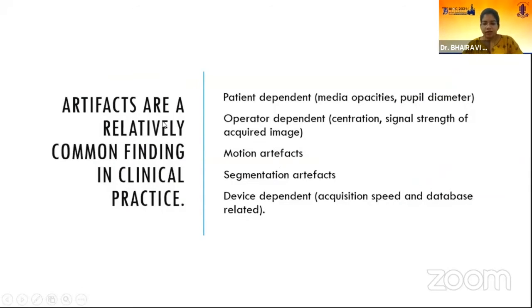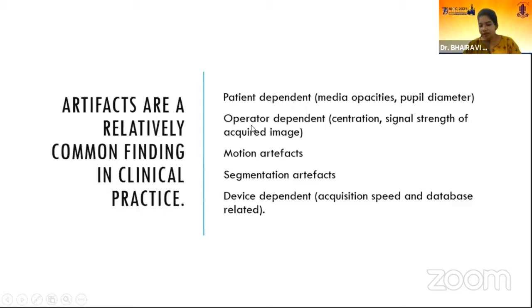Artifacts are very common in OCT findings. Artifacts can be patient dependent or operator dependent, due to motion artifacts, segmentation artifacts, or they can be device dependent.